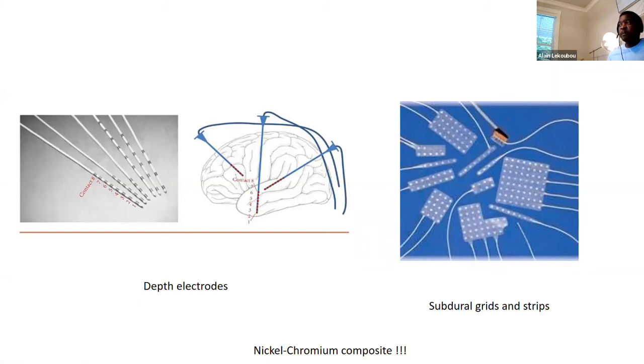And you guys understand that the brain is so big. I mean, there's so much volume in the brain that you just can't start plugging those depth electrodes anywhere in your brain. So you have to have what we call a clinical hypothesis. What I mean by that is that you have to have a sense of where they're coming from. Okay, let me tell you about this scenario so that you can understand it better.